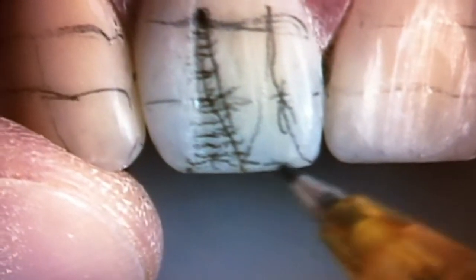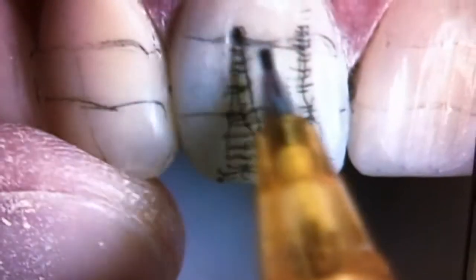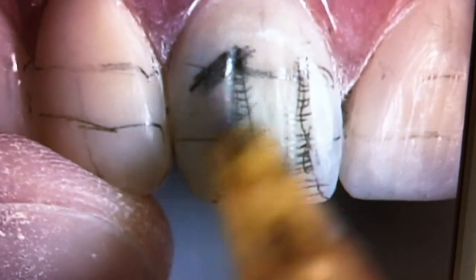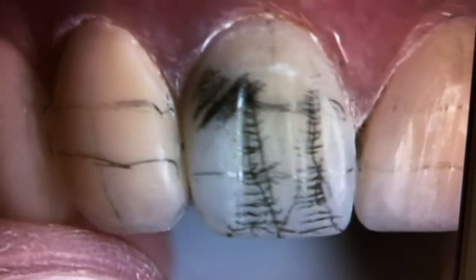Same here. So you've got the width, and shallower and narrower until it disappears. The only thing is that when you get to here, all of a sudden you start having a wider valley-like depression on the distal. So, on the distal of the central, even? Yes. I thought it was just on the laterals. No, the central also has a little bit of a valley there.